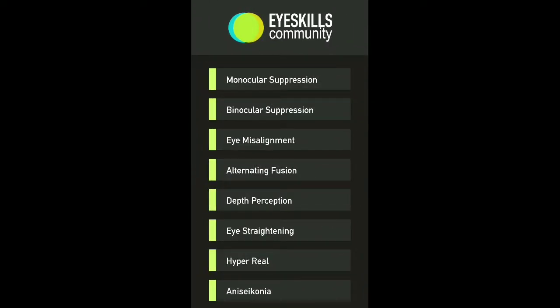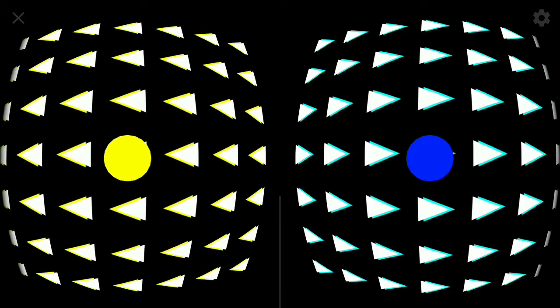Alternating fusion is a bit of an experimental scene for people with alternating strabismus. And the idea is, once we go in there, if you press up, it'll add a conflict background, which is actually what you want, probably. So up being W, because you want one eye or the other to dominate. In fact, what we're doing here is you want to fix with one eye and then the other eye.